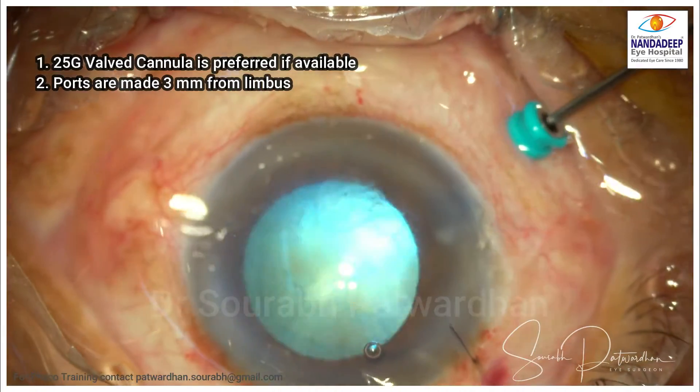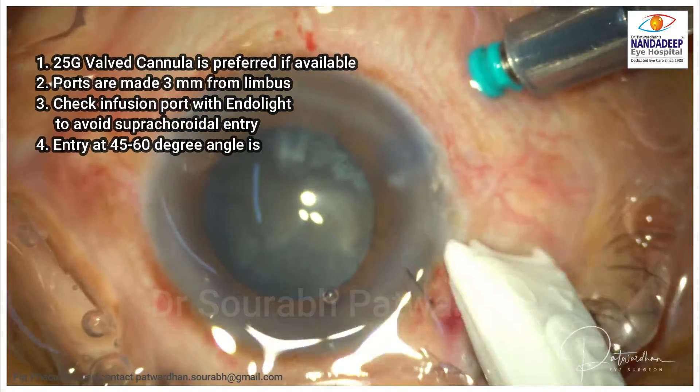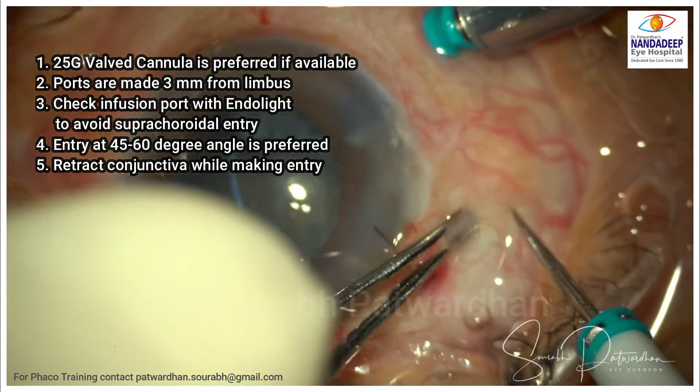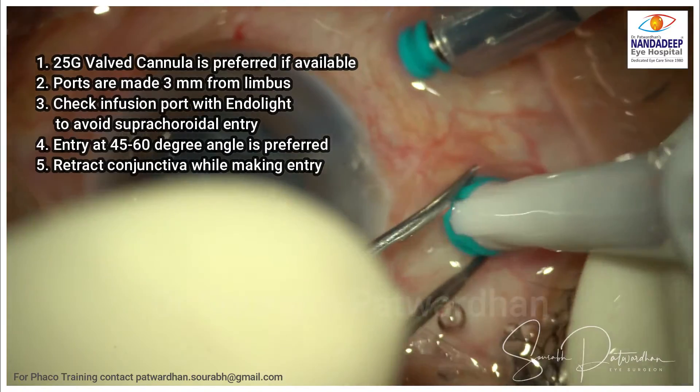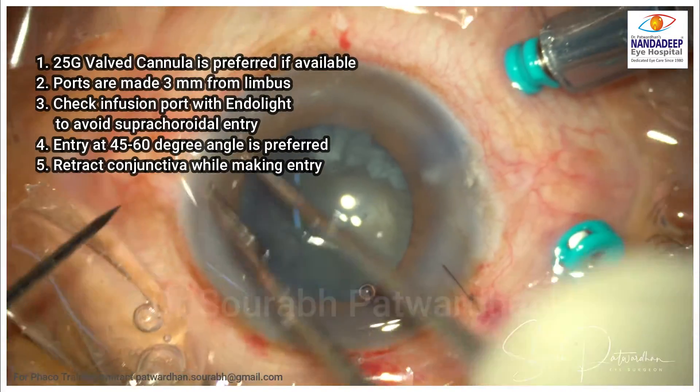I always prefer 25 gauge valve cannula for making the active ports. For infusion, it is okay to have non-valve. Ports are made at 3 mm from the limbus, and always check the infusion before starting the infusion cannula.